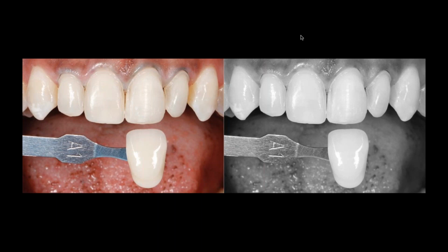But when you have, let's say, a nice shade of the teeth to start with, or a moderate color on your abutment, these feldspathic ceramics are really nice because they have the highest content of glassy matrix. Remember that what we are able to see is the value, the grayscale. So making sure that I nail the value and that I'm accurate in selecting the shade is one of the most important aspects.